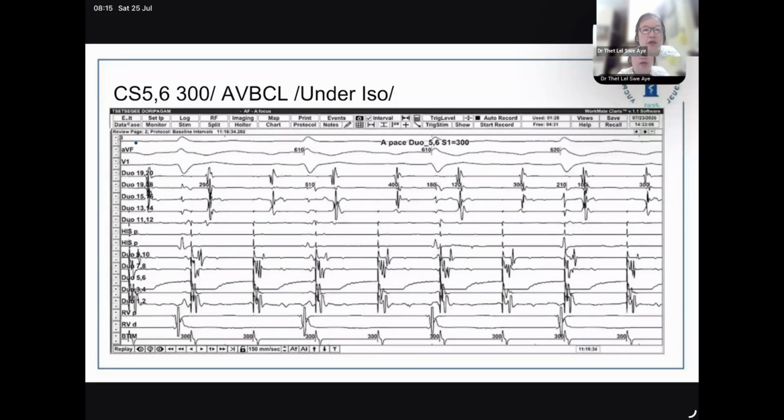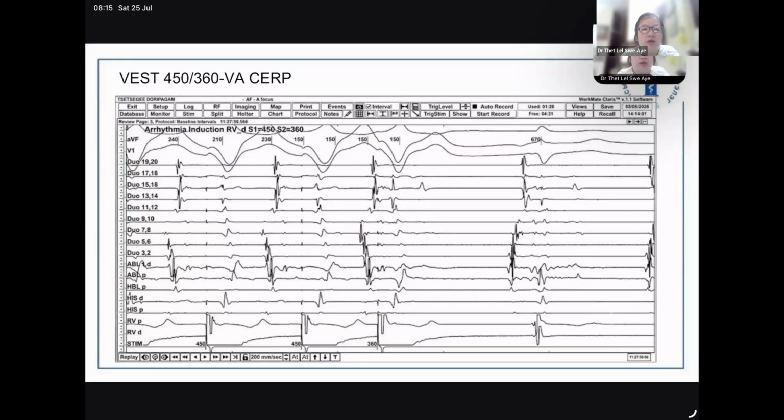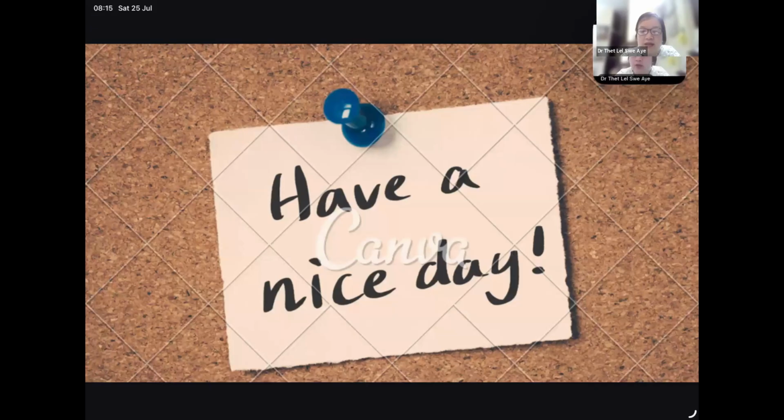Thank you very much, Dr. Anand, for your very interesting case of paroxysmal supraventricular tachycardia. We have so many cases of supraventricular tachycardia in our daily clinical practice, and it is usually not very simple in the EP study to have a correct diagnosis in the EP lab. So I like the way you presented before. You look at the ECG very well so that you can guess what the mechanism is. You described the RP period for the diagnosis of the SVT ECG, and another interesting one is the Holter monitoring.